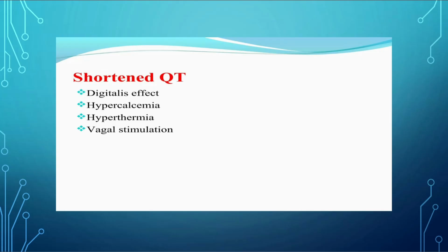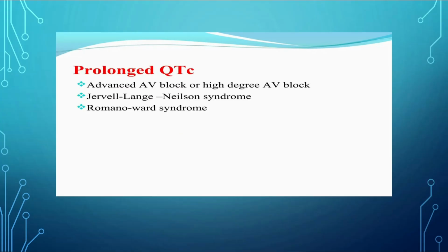Short QT interval: digitalis effect, hypercalcemia, hyperthermia, and vagal stimulation. So these are very important. Prolonged QTc and short QTc.